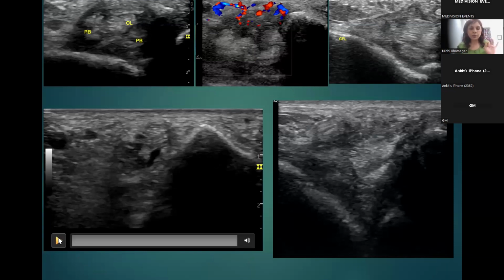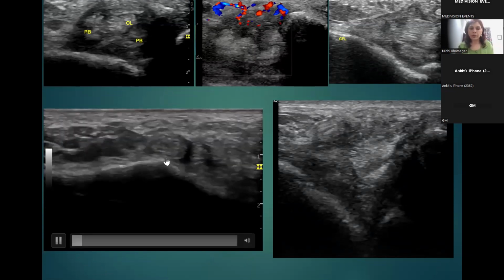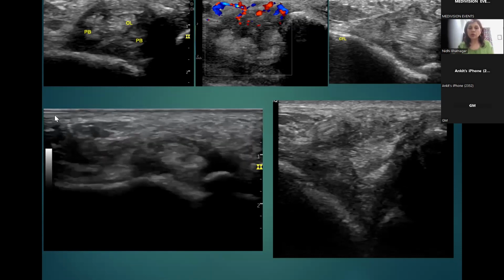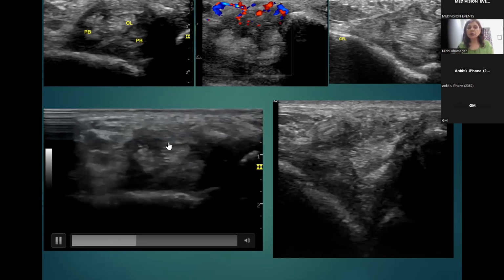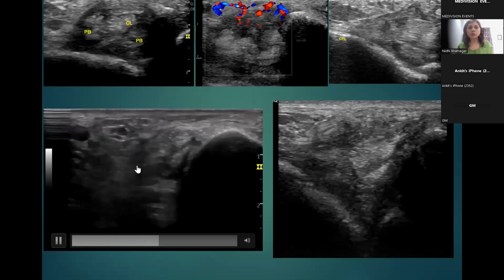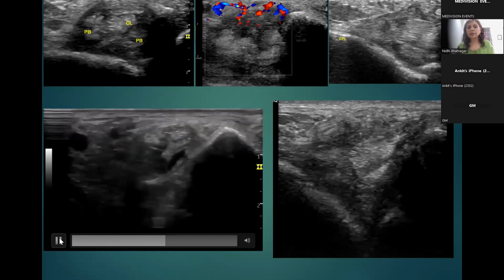Now, this video clip is just to show how we were able to diagnose the tear of the peroneus brevis, which was associated with the SPR tear also. And as we go from distal, that was a peroneal tubercle, we are going proximal, the two hemitendons with the peroneus longus, just in the inframalleolar region. And as we go, of course, there was a lot of tendinosis, a lot of synovial proliferation as we went proximal.